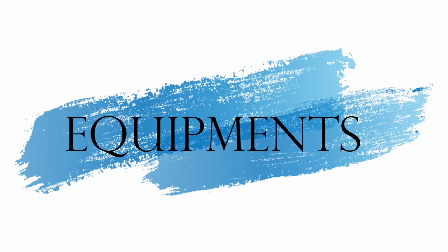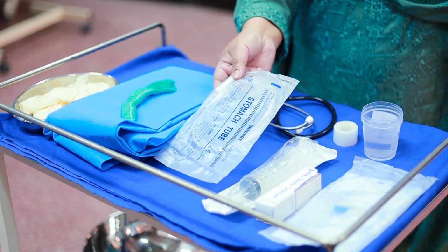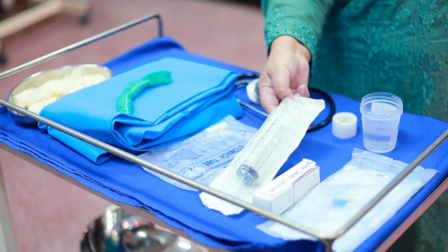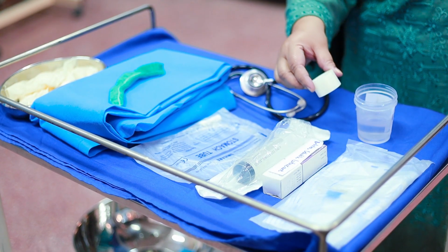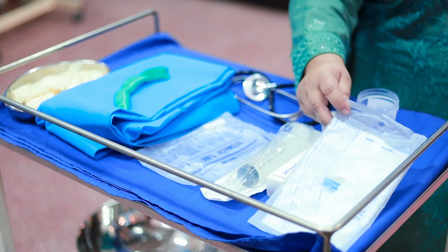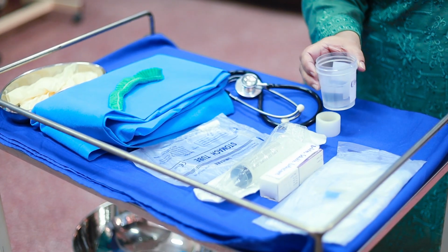Let's look at the equipment. Personal protective equipment, NG tube, 60 ml syringe, 2% xylocaine jelly, adhesive tape, drainage bag, stethoscope and a cup of water.